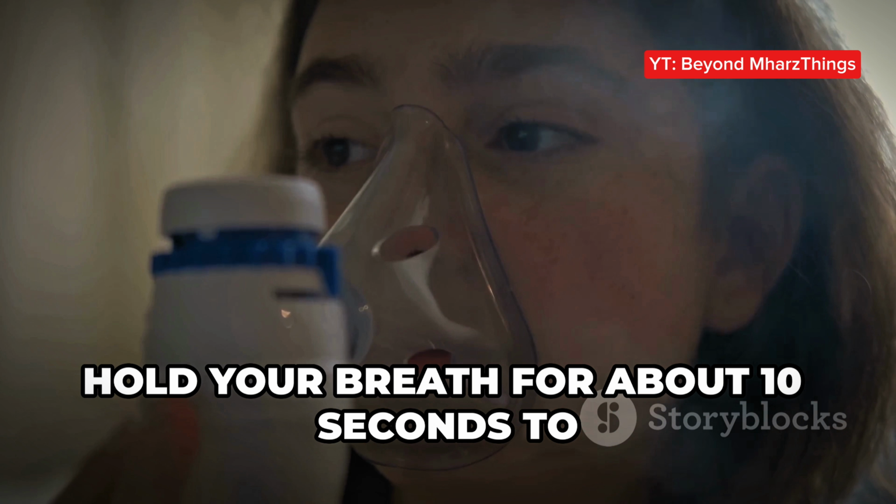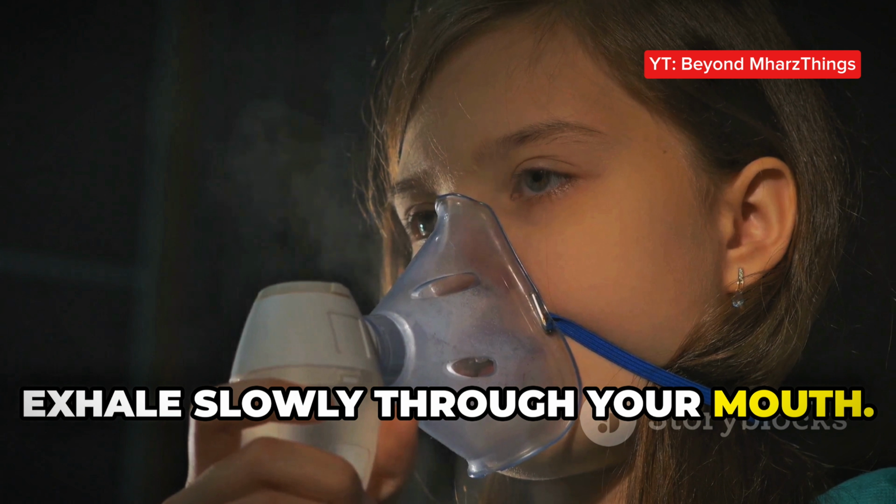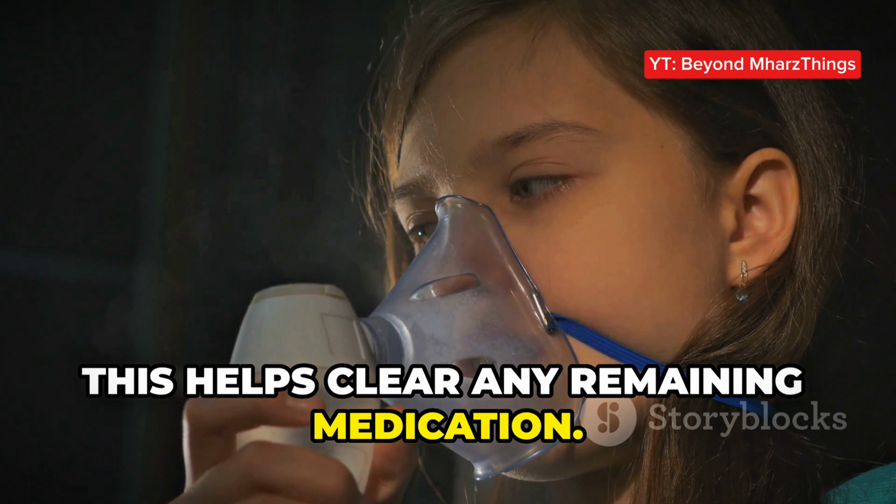Hold your breath for about 10 seconds to allow the medication to settle. Then, exhale slowly through your mouth. This helps clear any remaining medication.